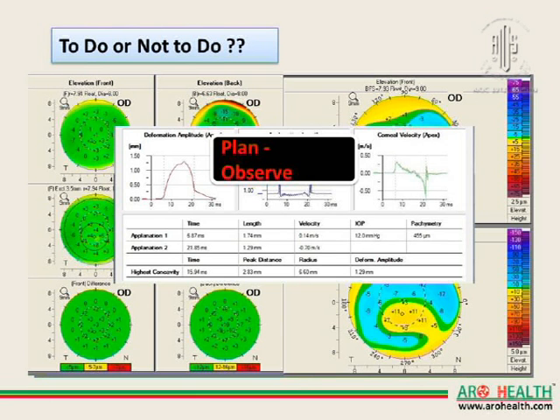Let's look at another example. This is a Pentacam of a patient. All the points look normal to me, except that in the anterior keratometry and the anterior sagittal curvature you see a little bit of asymmetry. The difference map is clean. But when you look at the Corvis, the deformation amplitude is 1.29.